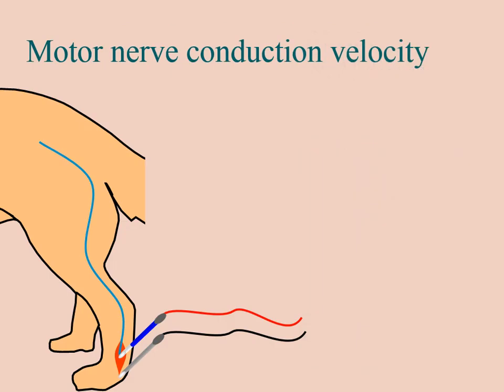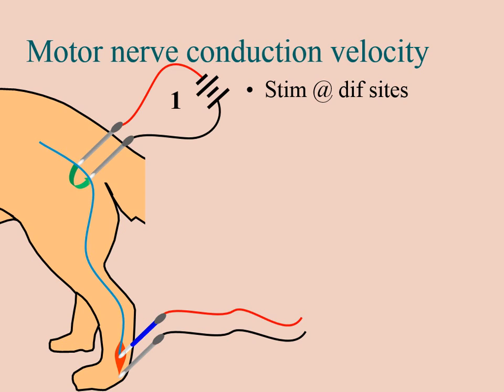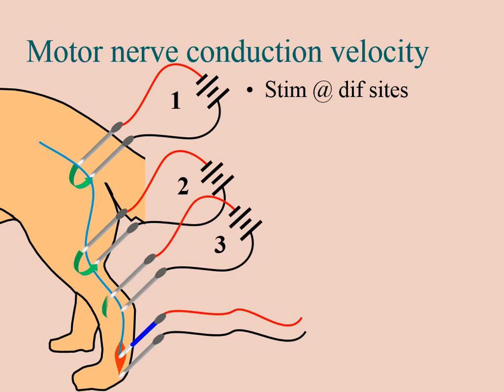Now, the other thing that we use these evoked responses, these compound motor units for, is to do a nerve conduction velocity. To measure the velocity of the nerve, we're going to stimulate the nerve at different sites. So we'll take, for example, the tibial nerve and stimulate it as part of the sciatic up in the ischiatic notch. Then we'll come down and catch the tibial branch behind the stifle between the heads of the gastroc. And then we'll come down and catch it again just above the hock, behind the Achilles tendon. So we'll stimulate it in three different places.